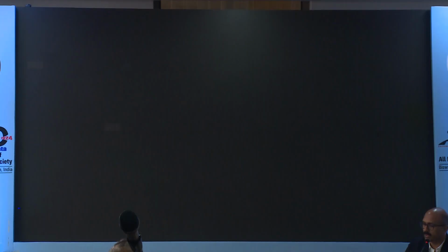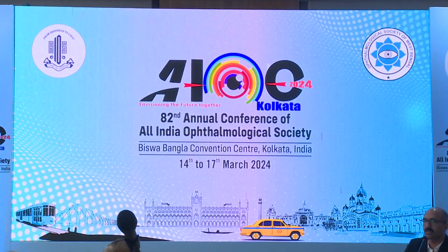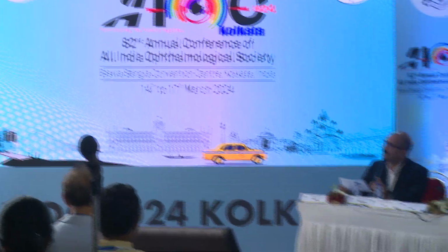Thank you, Dr. Ajay, for an excellent presentation on the usefulness of widefield imaging in diabetic retinopathy. As you said, even I follow that. Post-operatively, I keep doing an angiogram, which is many a time fruitful. Recently, the trend is towards doing an angiogram early in the course of diabetic retinopathy, especially a widefield angiogram, to look for capillary non-perfusion areas. At least you can stratify the patients on how frequently you want to follow them. One with larger capillary non-perfusion, you probably follow up more closely than the one with a lesser area of capillary non-perfusion. Thank you very much.